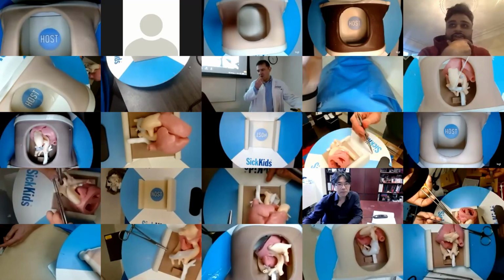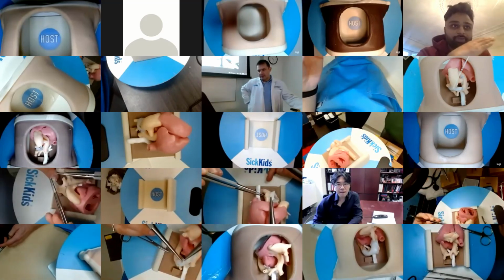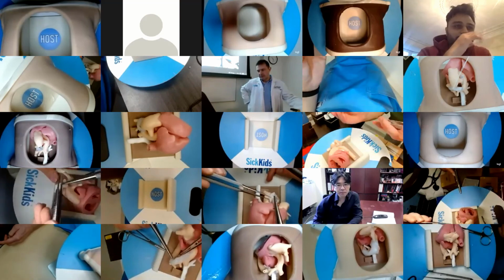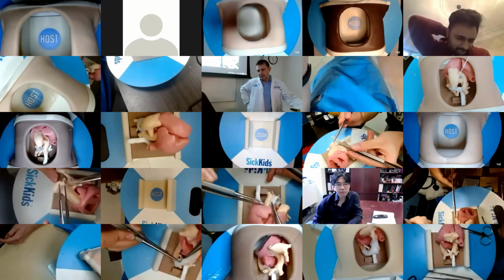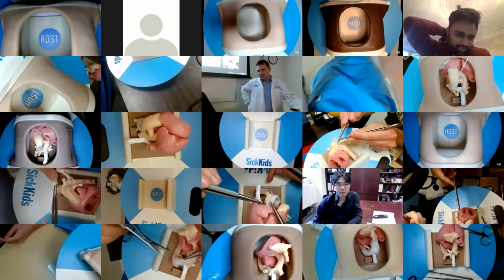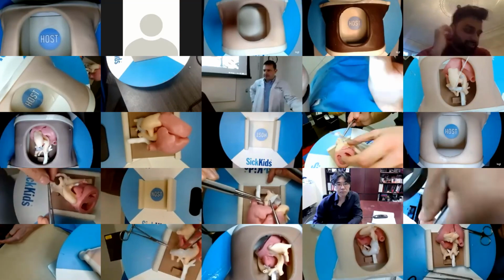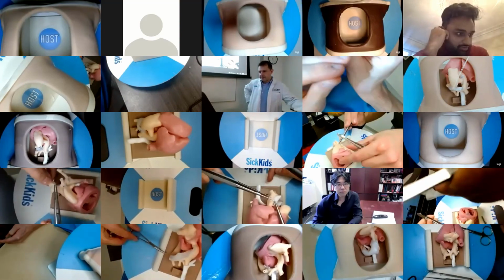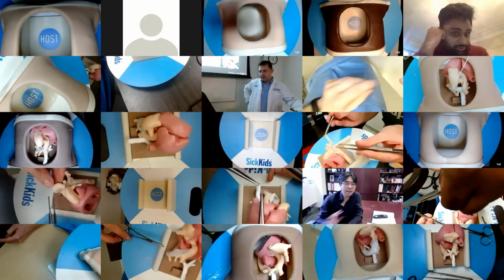Dr. Honjo, can I just ask, for the greater curvature side of your patch, initially you keep it straight. When do you make your first incision on that part? At what stage do you think about trimming that? And do you keep it straight, or do you curve it with the greater curvature of the aortic arch? For whatever reason, we don't need to trim that much.